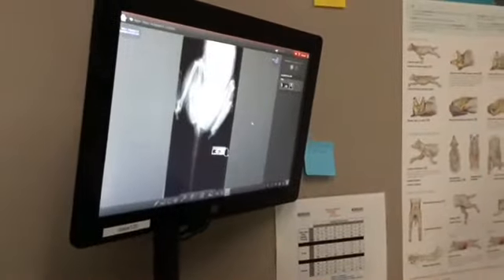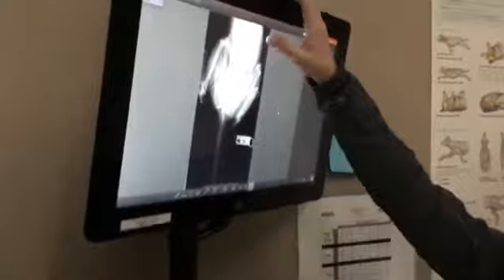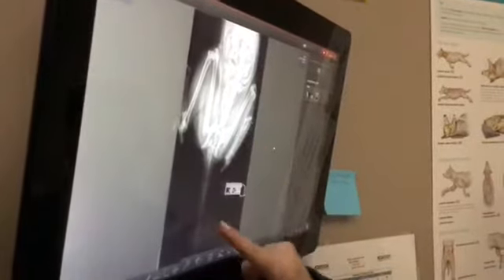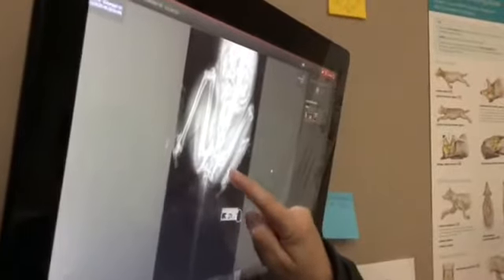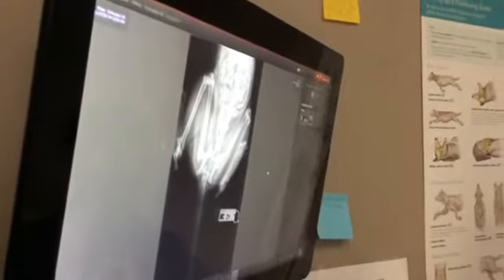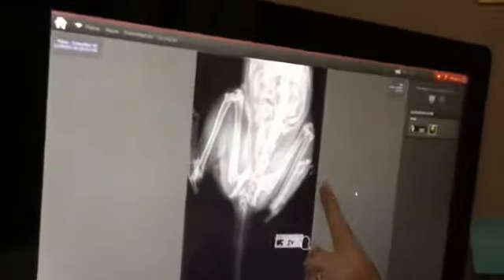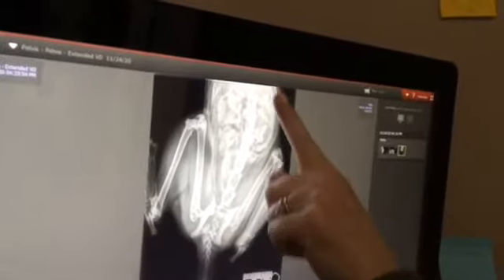Another picture that we took, this is him on his tummy. His head's gonna be up here, which is cut off on the x-ray. Again, I didn't need his top half, but I needed to look at his tail. So his little legs are kind of frog shaped there a little bit. Again, this is looking at him through his tummy, and his tail goes this way. We put a marker in there that tells me this is his right side. That is his foot there that you see, and his leg bones there, his pelvis and his spine.